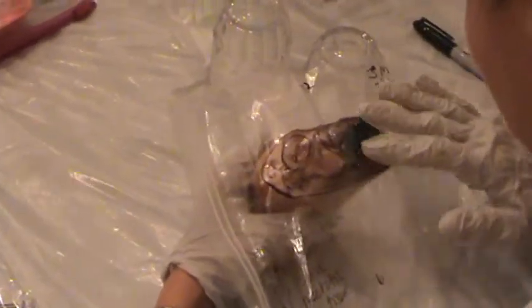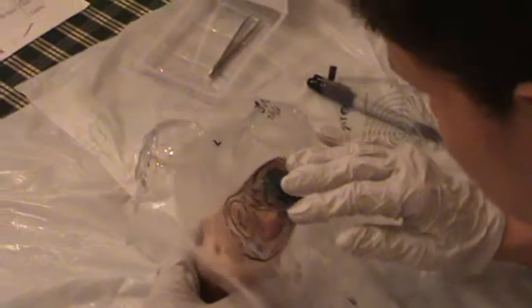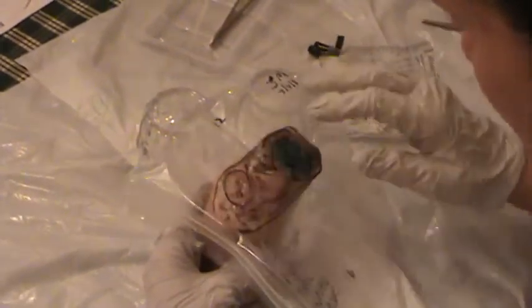The next thing I'm going to be doing is measuring the surface area of the necrotic area. First I'm going to measure it on my baggie. So I'm going to put this back on here. I am going to measure with the centimeter ruler. Just get the orientation correct here.